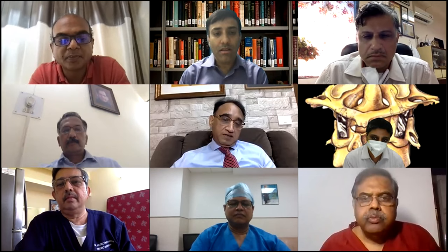Can I ask a question to Dr. Sanjay Behari? Yes, sir, please go ahead. That was a very nice presentation on the anatomy. I have a question: would you consider the entry point for C1, when you are putting the lateral mass screw, to be on the ridge rather than under the ridge?